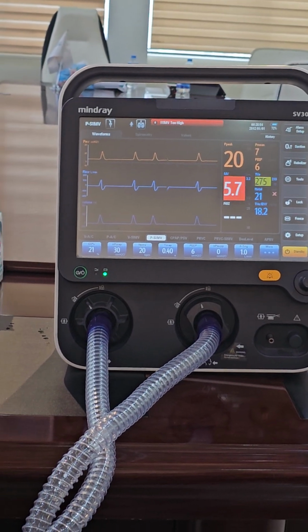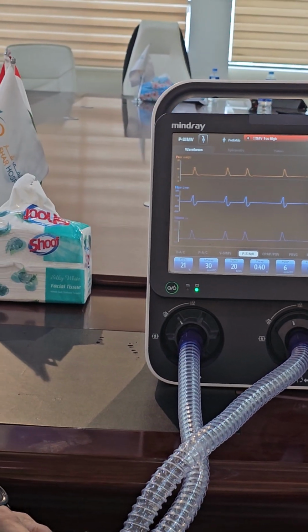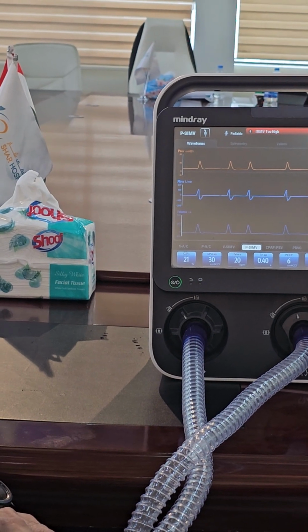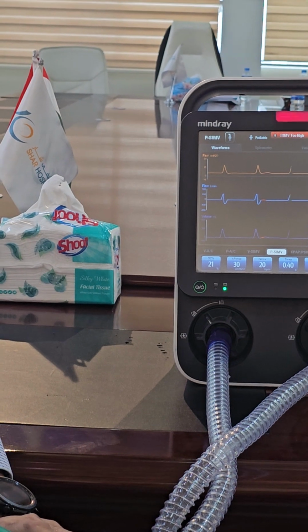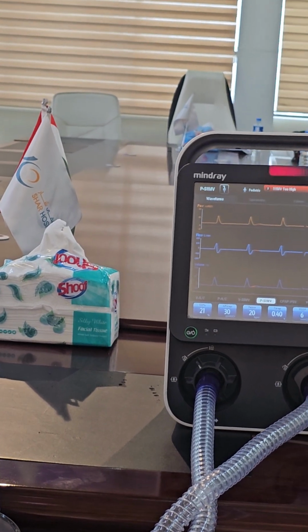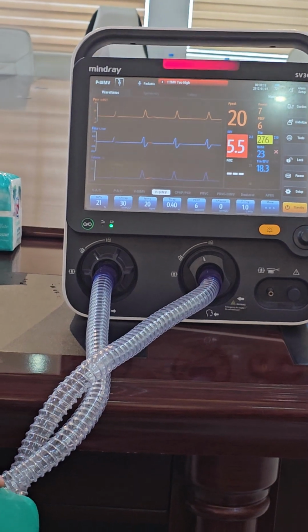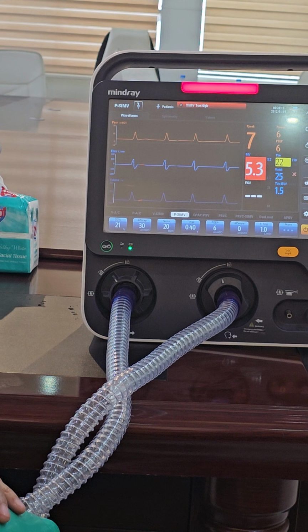You understand the difference? Okay. Regarding the breath in assisted control, which type will you see? We have three types of breath. In assisted control, you will see assisted and control, the mandatory.